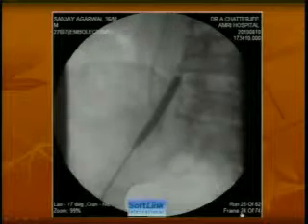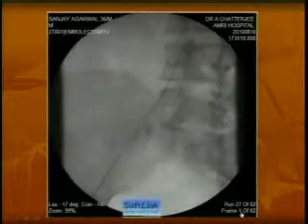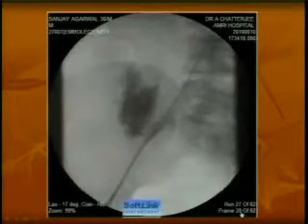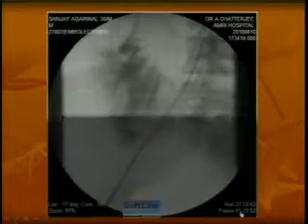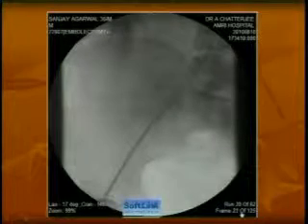Now, it was a very tight lesion, so I had to do a post-stent dilatation. And now this has happened. There was a rupture there with a leak, which I managed again by deploying another covered stent with overlap at that point to close off the leak. But it was such a tight lesion that even the covered stent I had to again post-dilate.